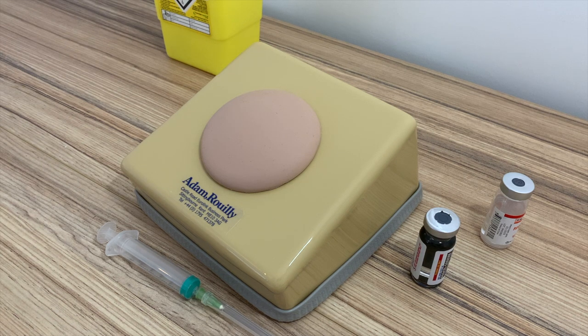Adam Rooley is delighted to announce the launch of its latest product, the AR18 Intramuscular Injection Simulator. The simulator has been designed to be economical and durable and also offer a realistic training experience for intramuscular injections.